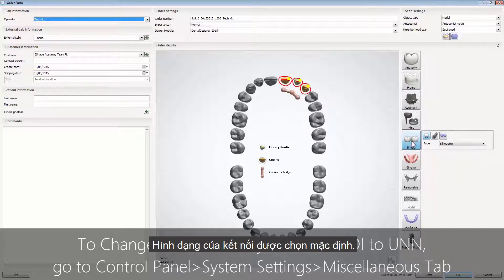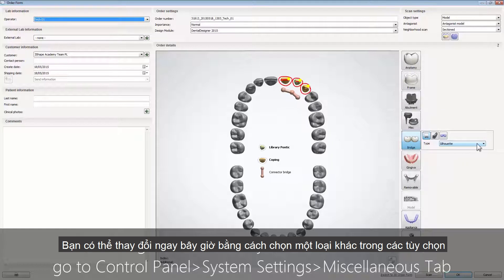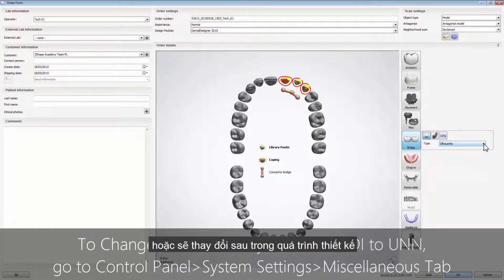The shape of the connector will be defined by default. You can change it now by choosing different shapes from the drop-down list, or modifying it later during the design process.